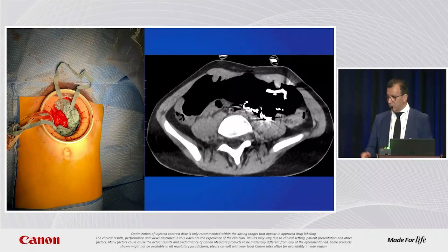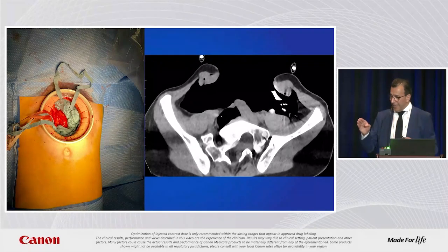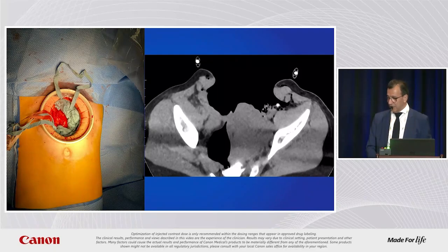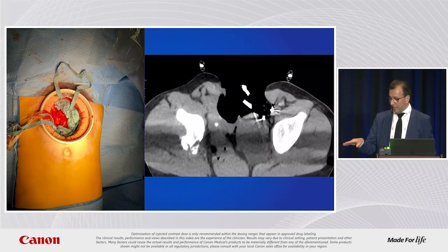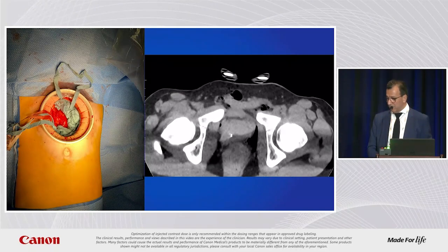Here we are. I have the tumor. I do my CT scan at this moment. You have the gas, and what I have seen is that the rectum cannot go so deep in the pelvis, it is still in contact with the tumor. So I need to add a hydrodissection of the rectum with HydroGuard. Quickly again went there, and you can see behind you have still the rectum coming in contact with the tumor. That will be dangerous to freeze.